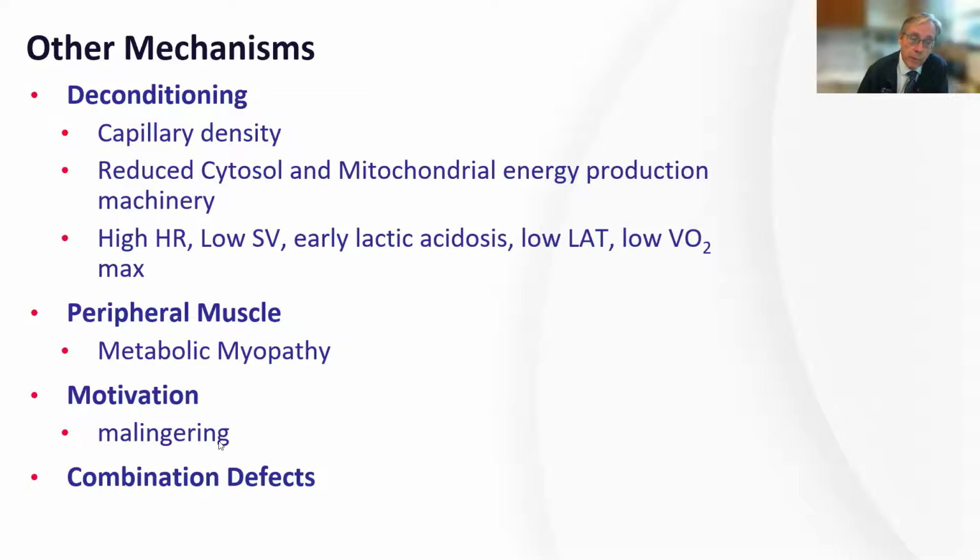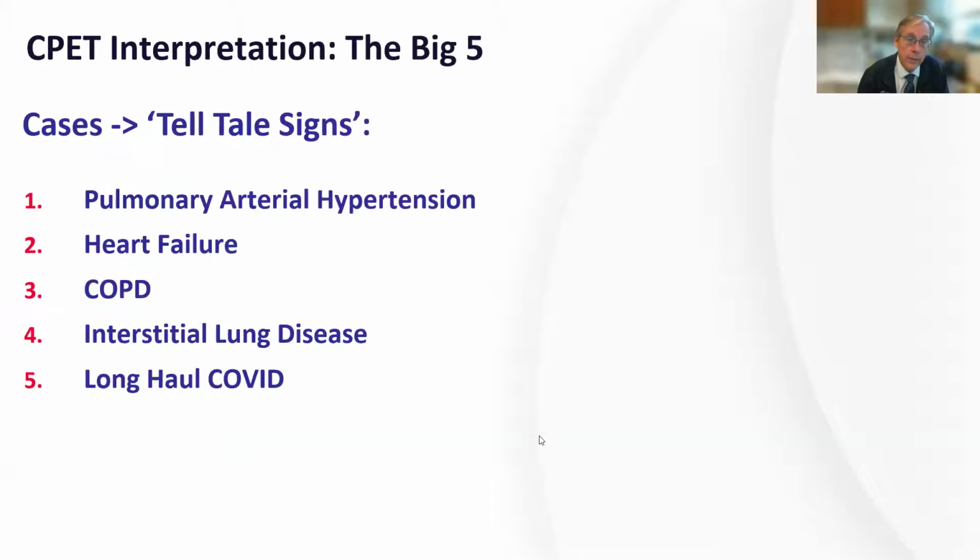And finally, motivation, and this is very important, I think, to be in the room as well, to see if somebody just sort of stops and there's no real reason and they don't have a reason. Maybe it's some kind of evaluation of their work fitness, et cetera. You want to be able to have an assessment of how much they actually tried during that study. And again, your technicians should be documenting that. And finally, of course, the real beauty of CPETs is you actually get a hold of different types of interactive limitations that actually come from different organ systems.